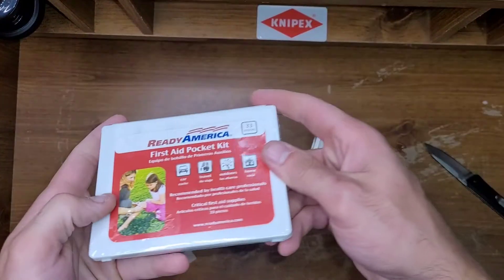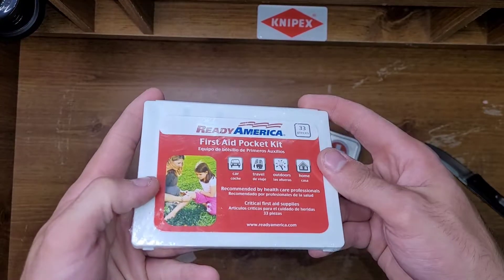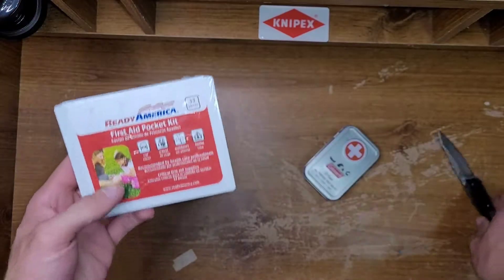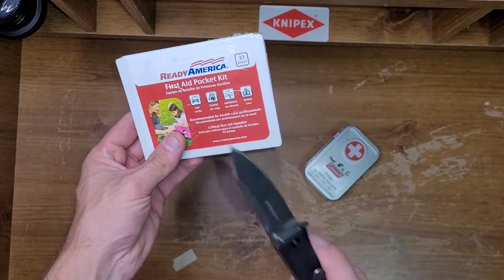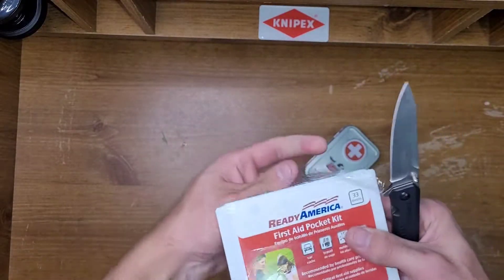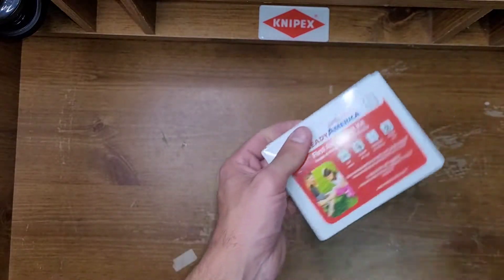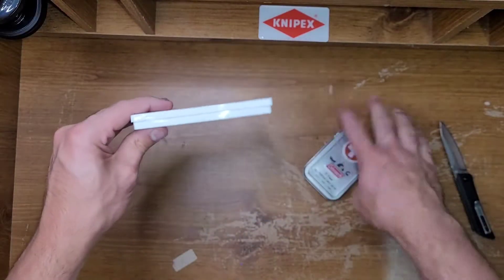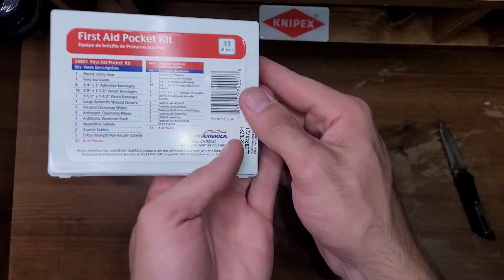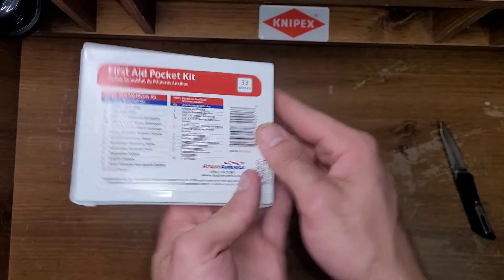Welcome back. We're gonna take a look at another one here. This is the Ready America first aid pocket kit, 33 pieces compared to 27. It says it's good for car, travel, outdoors, and home. Here's a tiny size comparison — very tiny. Contents right there.